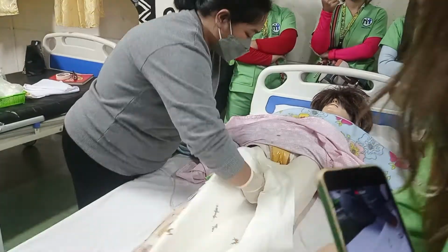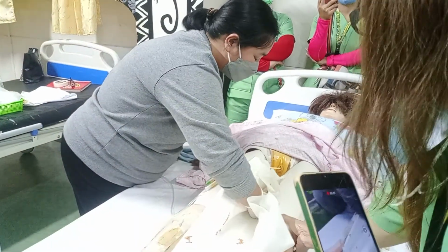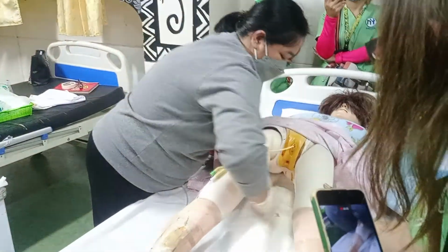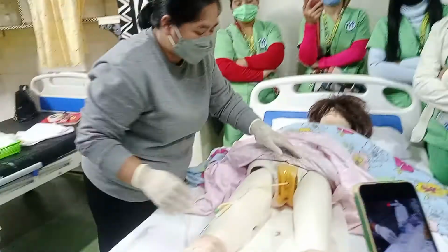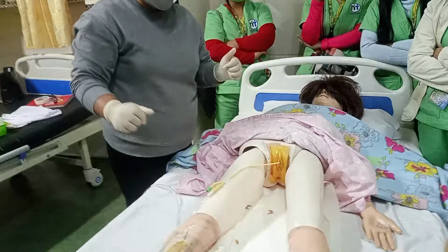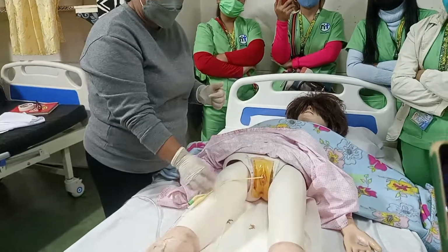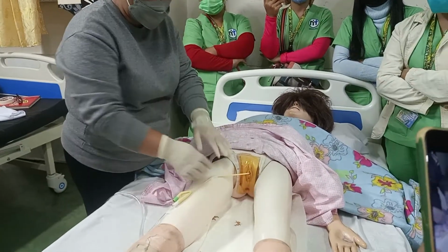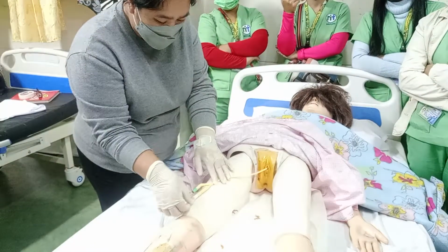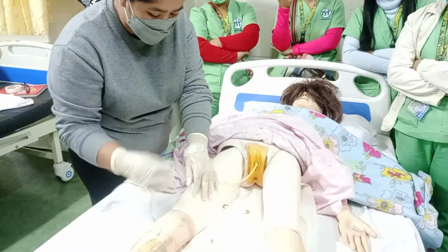So Mrs. Smith, can we raise your buttocks? Help me at the count of 3. 1, 2, 3. Okay. There you go. So, naka-dorsal na yan. Hindi ko na ito dorsal kasi hindi nyo kaya. Next, ano ang gagawin natin? We remove the tape. Para mas madaling hugutin mamaya. Okay? So, the tape, just put it here.